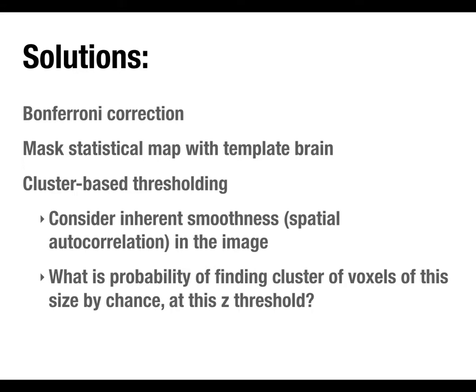It's actually a real danger because most fMRI software allows you to set the p-values, the thresholds. Some of them actually have sliders, so you can just move it up and down until it looks nice, and then say, oh, I like that threshold, I'm going to use that as my image. But then, of course, you have to write your results section and explain why you chose a p-value of 0.00729, and people get suspicious. So this allows you to be objective but principled about it.